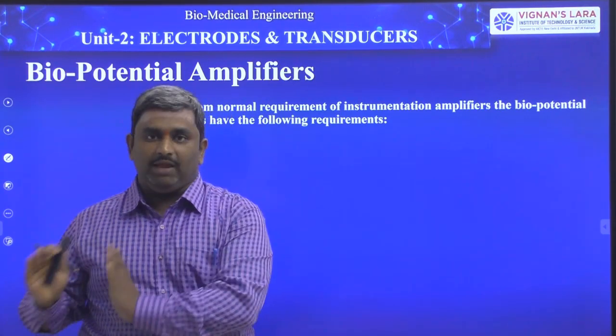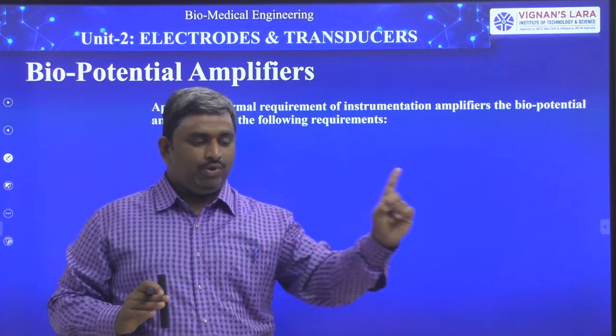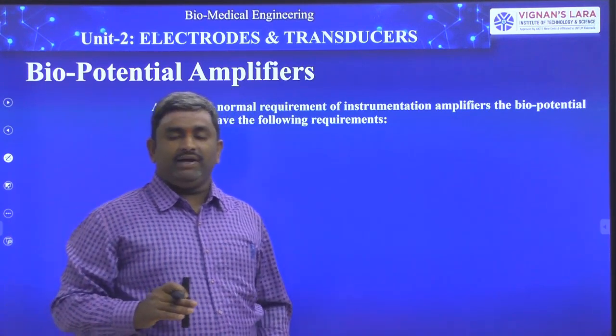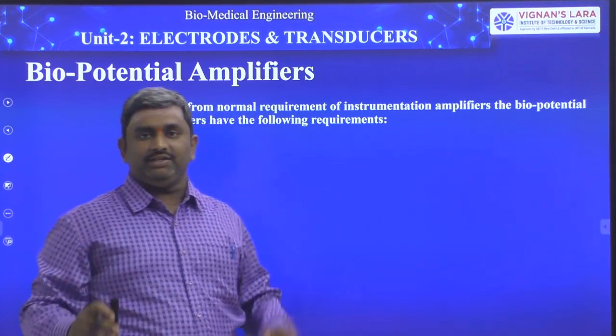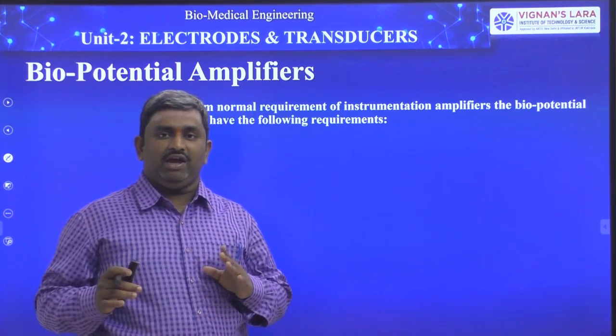Otherwise we have to take a printout, right? We have only two targets. The first one, we have to take a printout. The second one, we have to see on the display. But we have different sizes of displays: 15 inch display, 19 inch display, 20 inch display. Different types of displays are available.